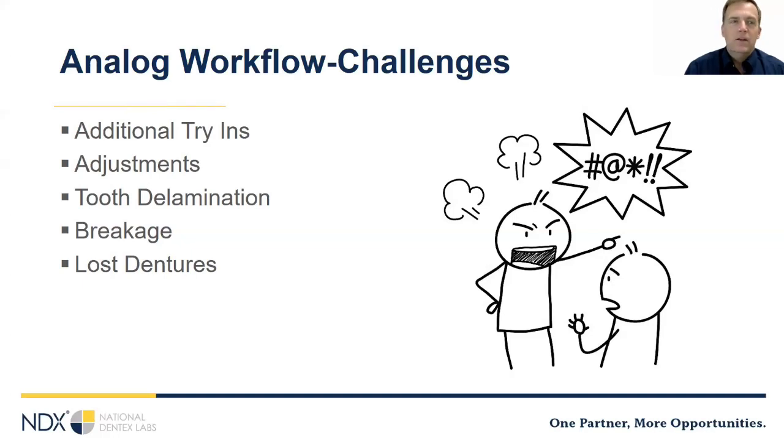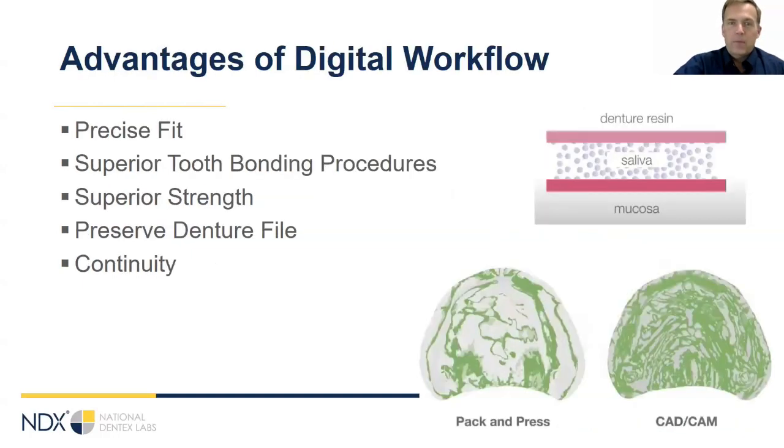How fun. So I think a lot of times because of all this, it's like, well, I don't want to do analog dentures in my practice. I'd sooner do things that are simpler. Patients like the results better, more predictable. So I think that's where digital workflows come in. So the first thing is the fit.